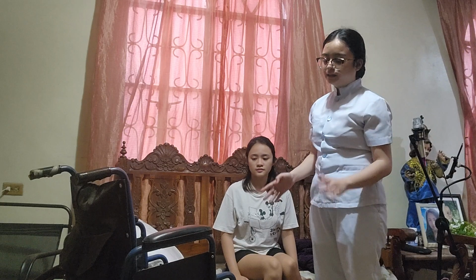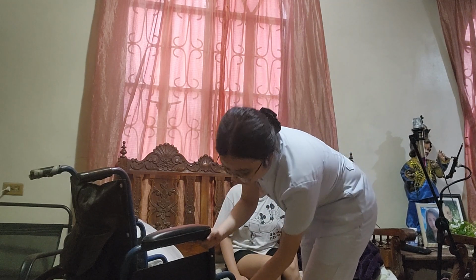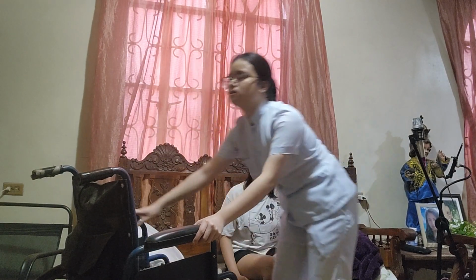And then here's my wheelchair. I will make sure that the brake is secured so that it will not move. If you are using a chair, you will need something to brace against, a secure object, so that the chair will not move and prevent the patient from falling. So I have secured the wheelchair, and then I will put on my gloves.